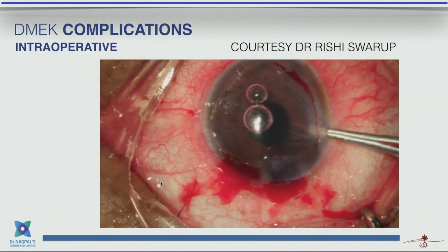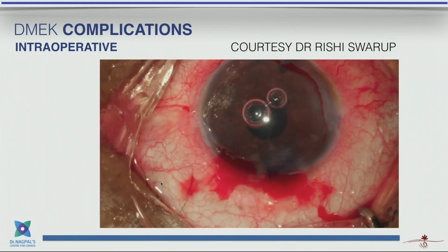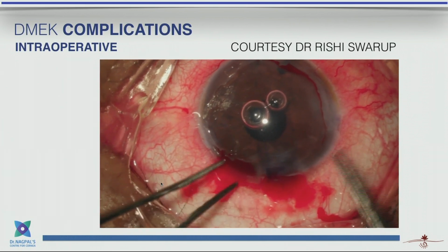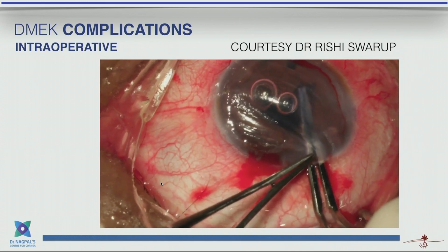Yeah. I think essentially the anterior chamber was pressurized. So possibly when I felt that it was a little tight, I could have, before withdrawing it, also decompressed the paracentesis and let out some more fluid, and then withdrawn my cannula. That could have prevented the situation.